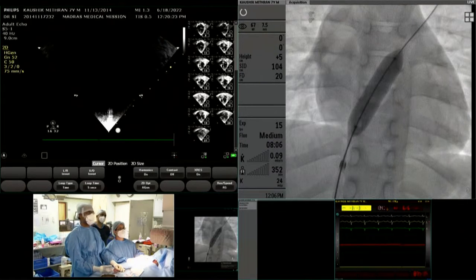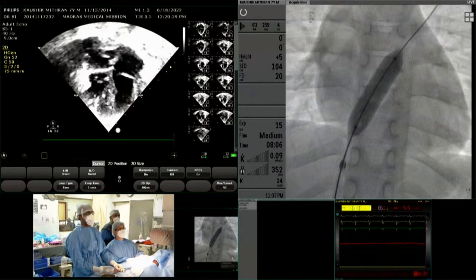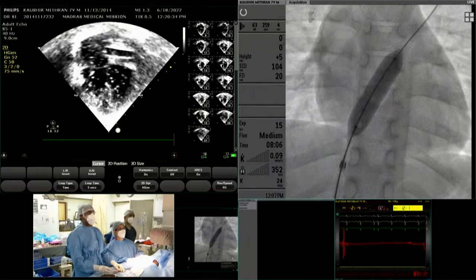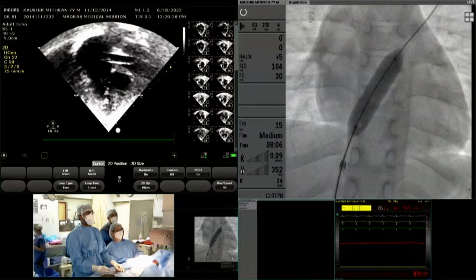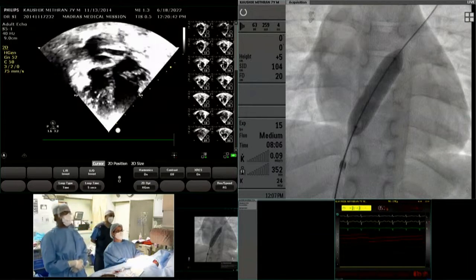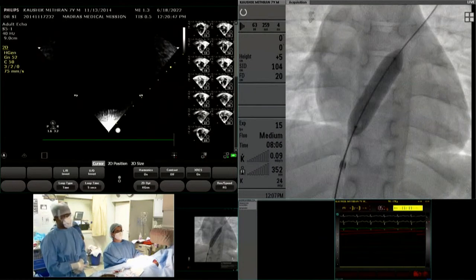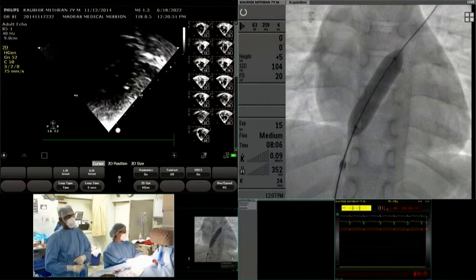Show this apical four chamber. Okay, sir. One second. Sir, I'll go to subcostal and have it. Subcostal windows are good, which is a good thing for this patient. All the ASDs are not being closed; we could close one of them in this non-conventional approach. Actually, Dr. Rita, I have a completely different idea. This particular child is prone to prolonged hypoxia with reduced effort tolerance.